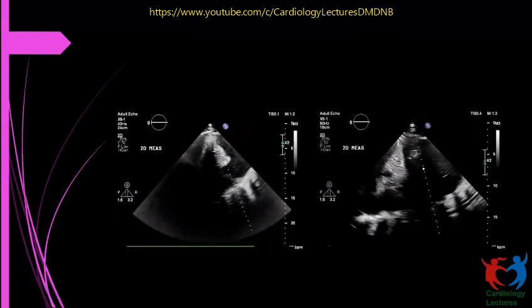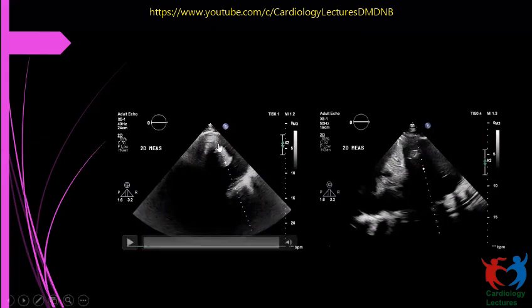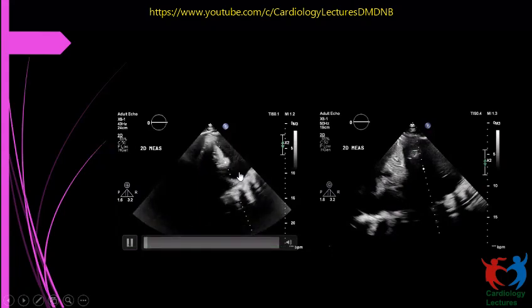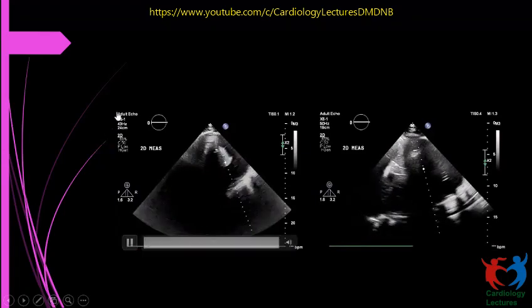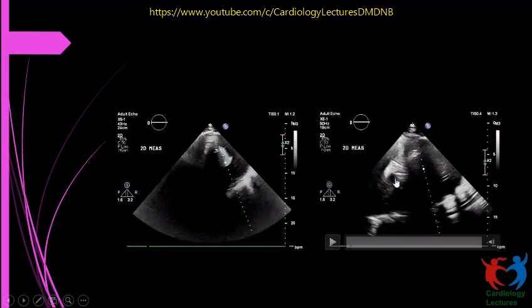Here you can see the lung is collapsed because of the massive effusion. If you take a diameter from the medial aspect of this lung to the parietal pleura, and this diameter is 10 centimeters, then it becomes 1,000 ml of effusion. You can see multiple fractal lines inside. These are secondary to the collapse.